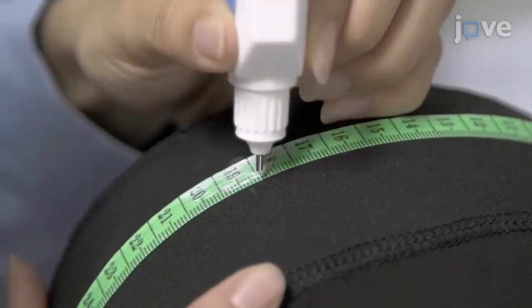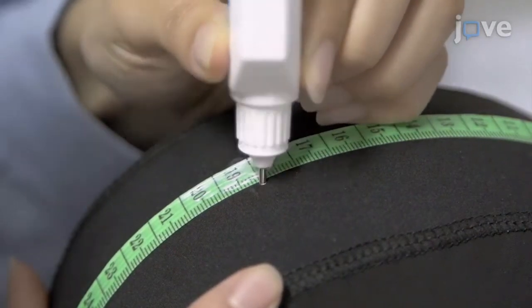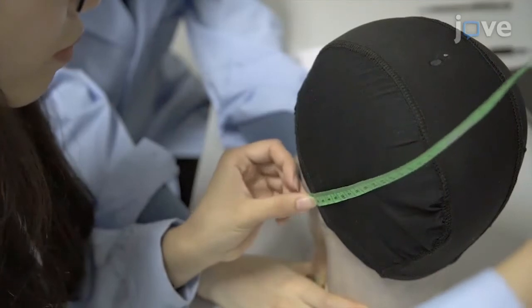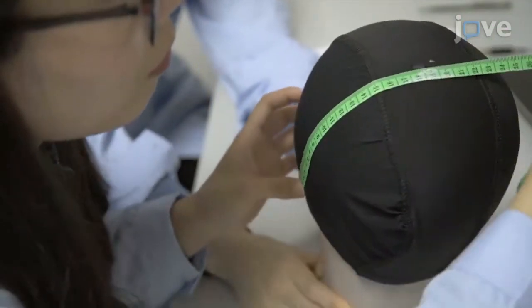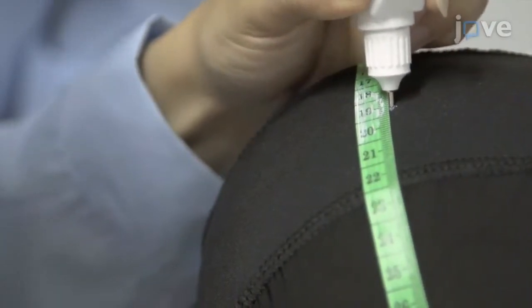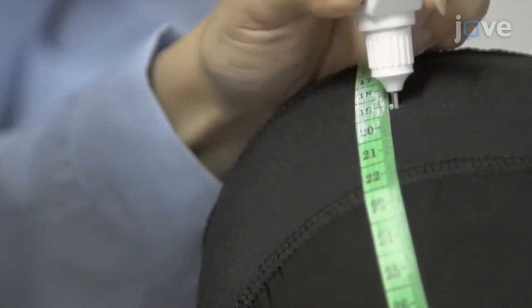To localize the vertex, use a skin marker to mark the midpoint of the distance between the nasion and inion, and measure the distance between the preauricular points. Mark the midpoint of the preauricular points. The point at which both midpoints intersect is the vertex.